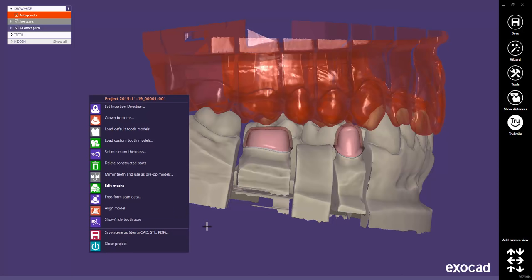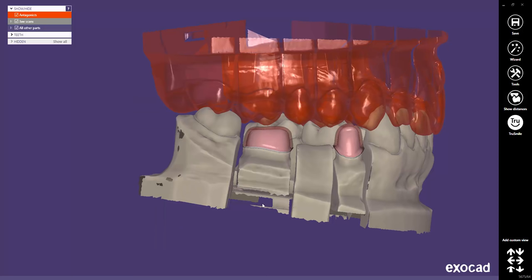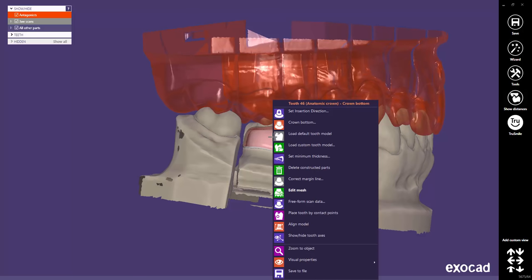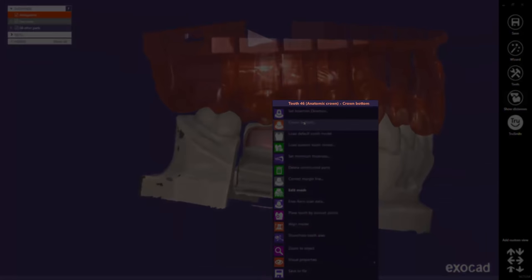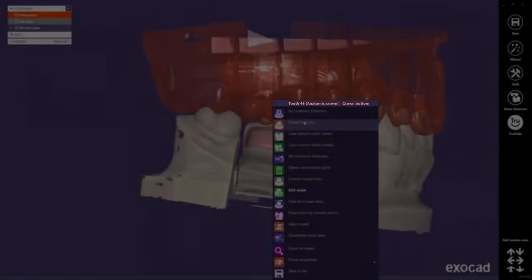To select a tooth with the right mouse context menu, right-click on the desired restoration part, then select the desired work step. Here too, the active part will always be indicated on top of the context menu.